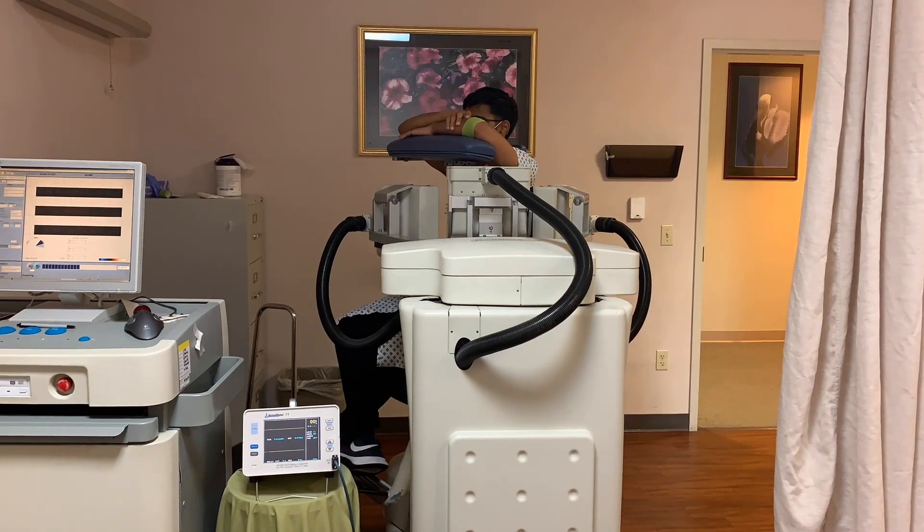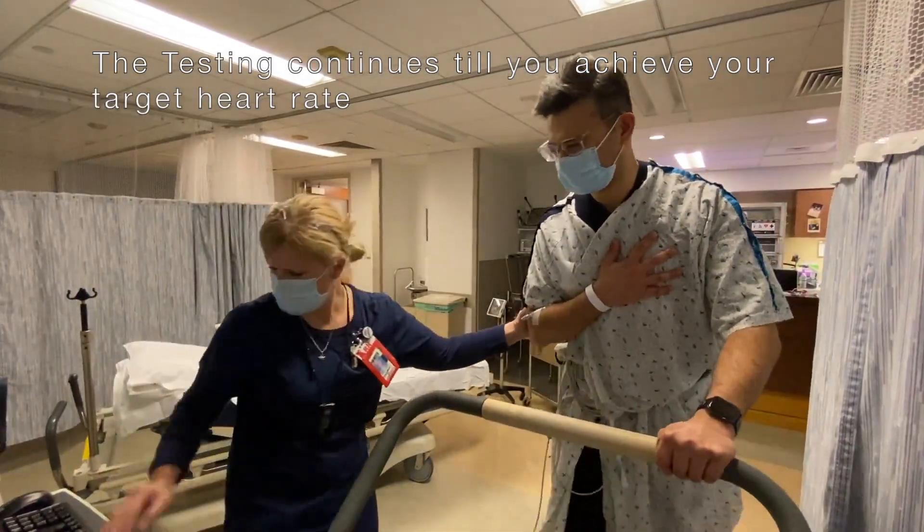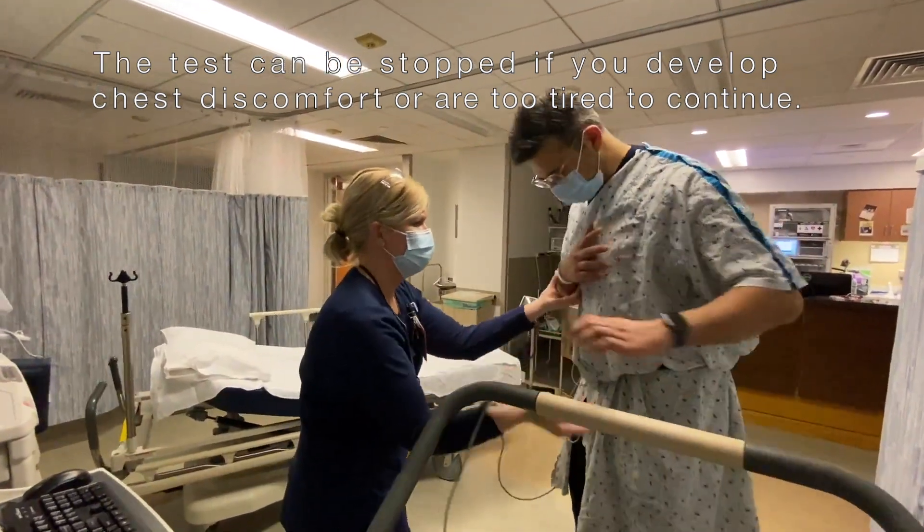You will be rescanned in front of the special camera. The test stops when you reach your target heart rate or develop chest pain and irregular rhythm, or become too tired and need to stop.